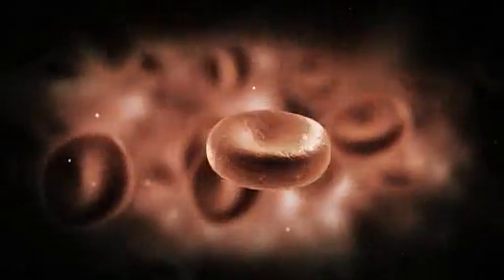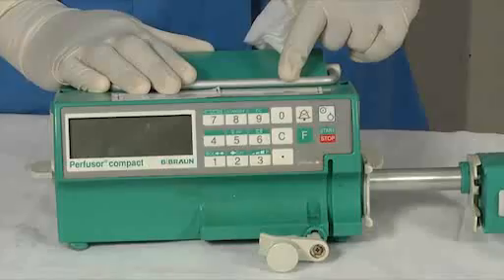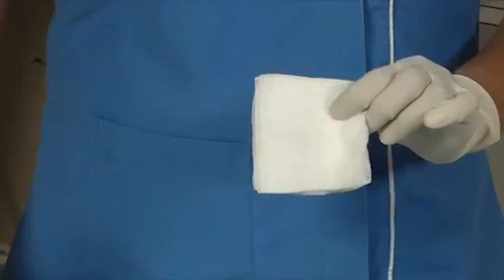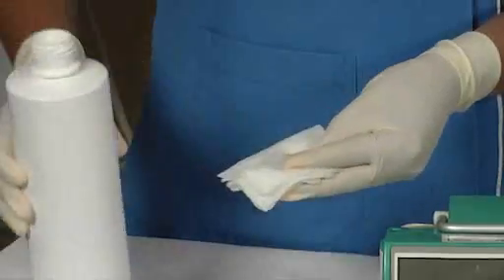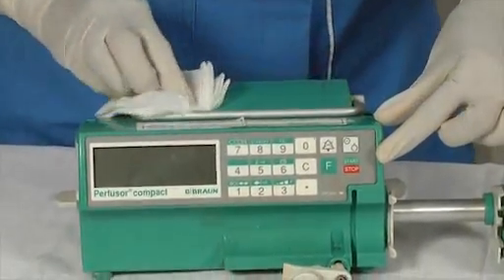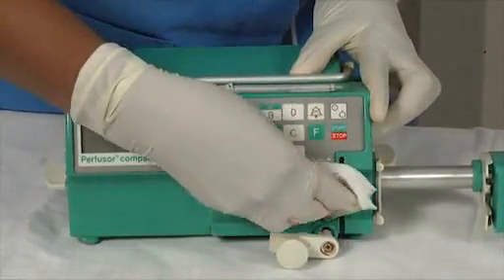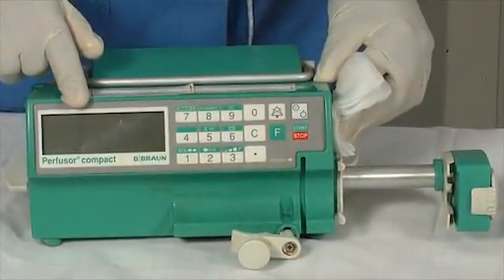Cleaning of the syringe pump. The syringe pump needs to be regularly cleaned for reasons of hygiene as well as trouble-free operation. To clean the pump, first take a piece of gauze pad and wet it with isopropyl alcohol. Start cleaning from one side of the pump. Never clean the screen or the touchpad with this solution — always use a dry gauze for that.